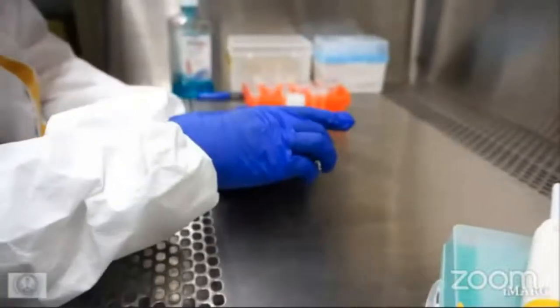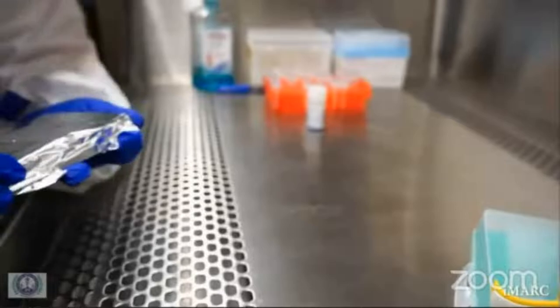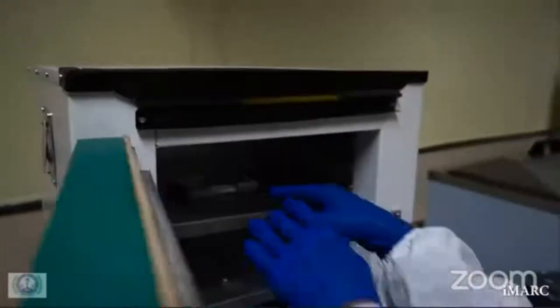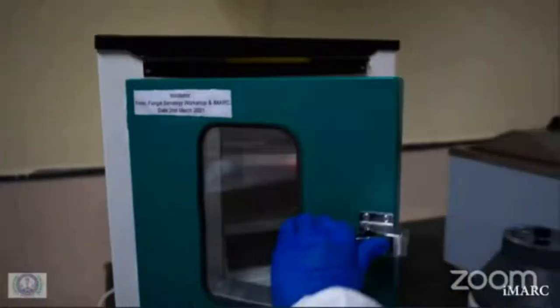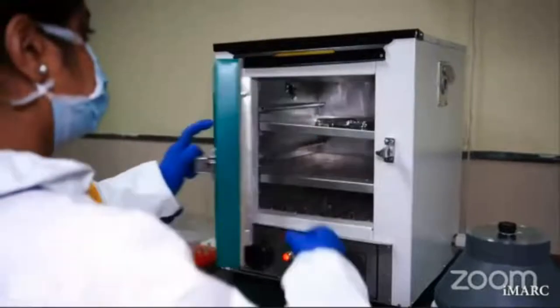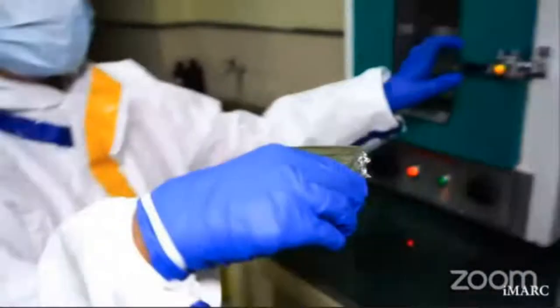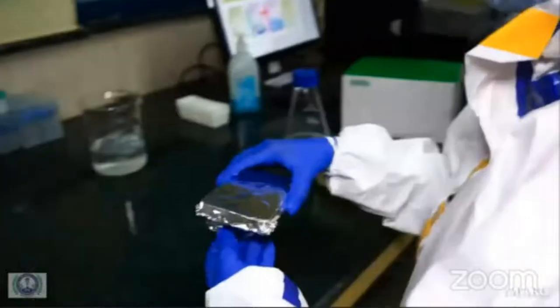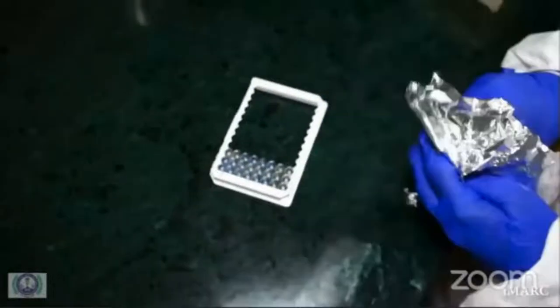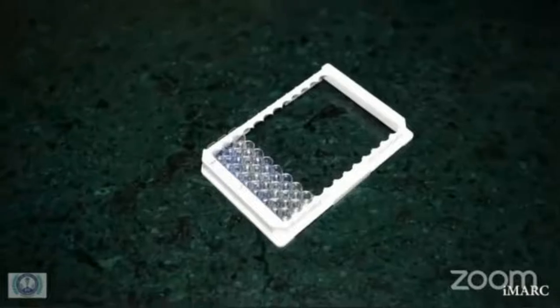Cover the plate with the plate sealer to prevent evaporation, ensuring that the entire surface is covered and watertight. Then incubate the microplate in the incubator for 90 minutes at 37 degrees centigrade. After 90 minutes, remove the microtiter plate, remove the plate sealer, and aspirate the contents of all wells into the waste container.